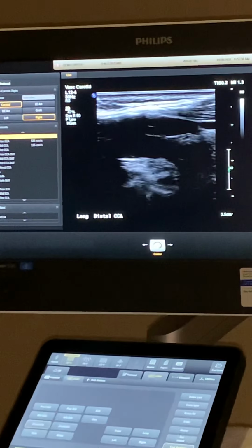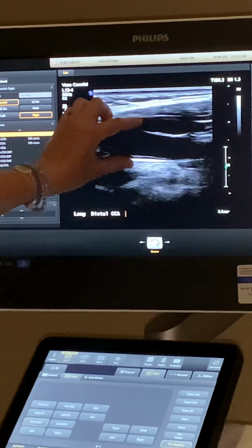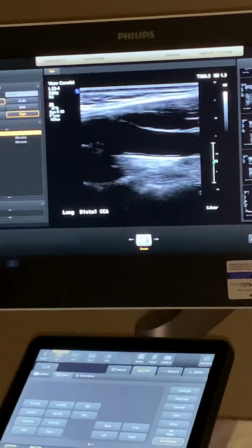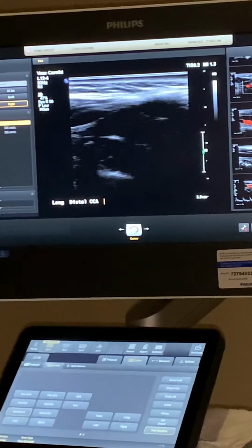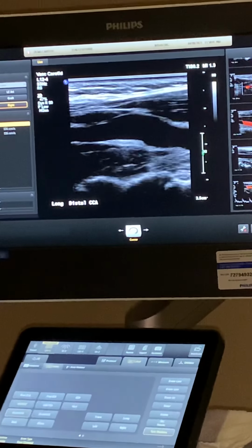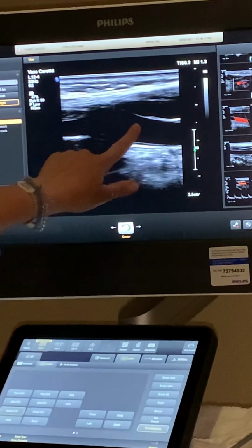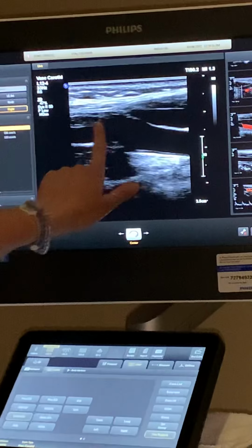and lengthen it out. In some cases you'll see this dilation happening here where you can separate the vessels. Sometimes it'll look very similar to the distal's diameter. But if you can go up to the bifurcation and see where it splits, then you can differentiate the distal and the proximal ECA or ICA from the bulb itself. So here we have distal CCA, bulb, prox ICA.